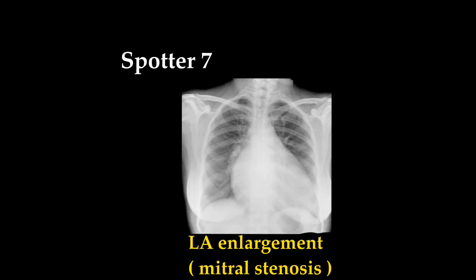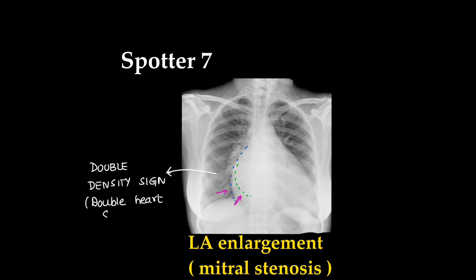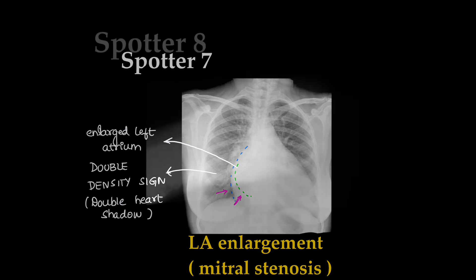This is a chest x-ray which shows left atrial enlargement due to mitral stenosis. Here we can see the double density sign, nothing but the left atrium and right atrium shadows overlapping each other. This is the enlarged left atrium shadow which is coming behind the right atrium.